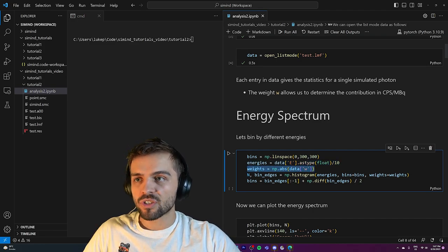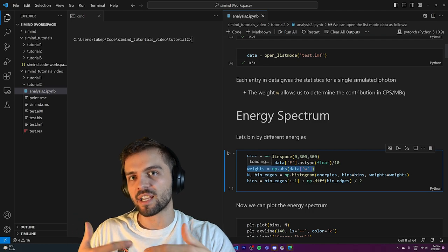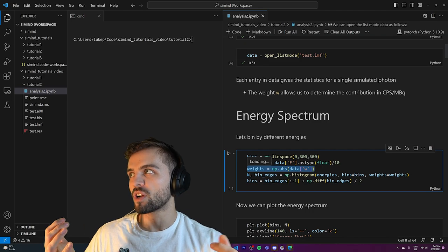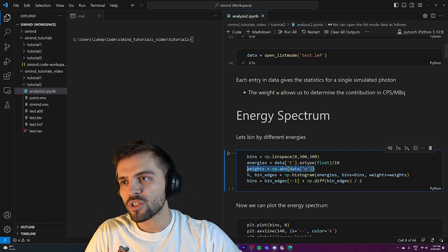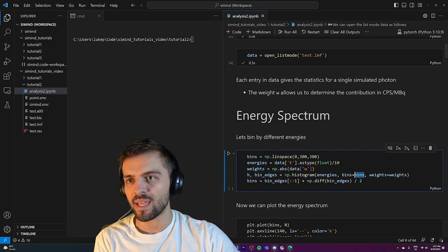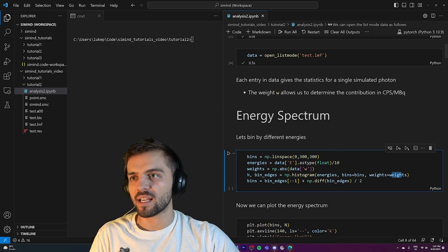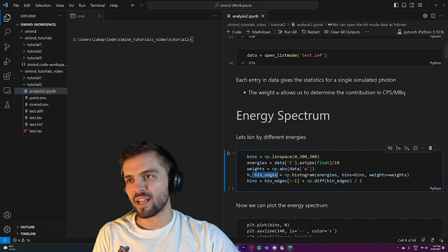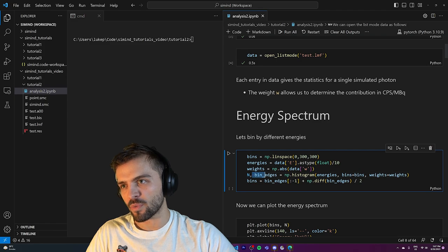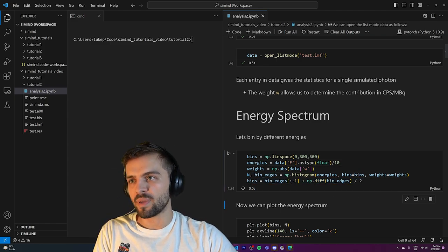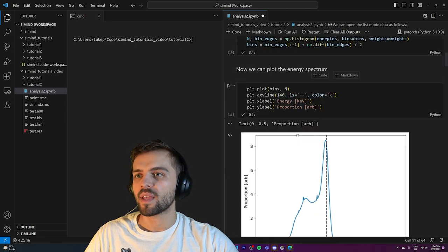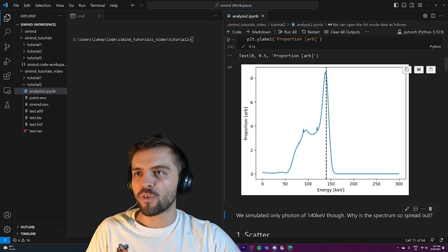I extract all the energies and the weights — the weights give the contribution of each photon in counts per second per megabecquerel, representing how much each photon will relatively contribute to the scan. I use these weights when binning the histogram, calling np.histogram with the energies, bins, and weights. I get the bin centers to plot a spectrum. This creates a histogram of all the different energies from the list mode file.